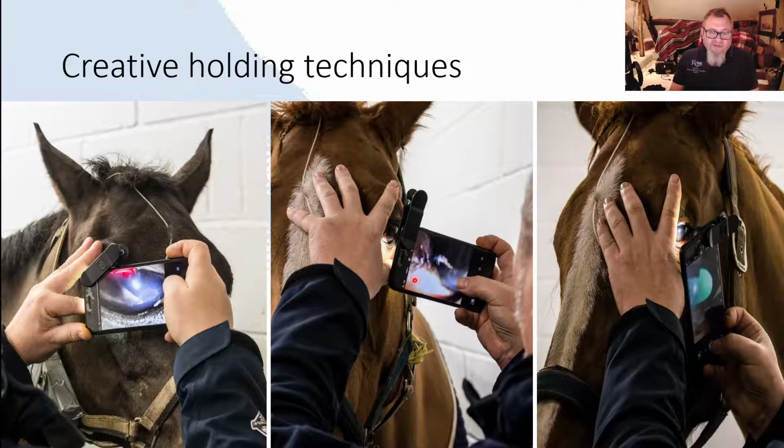In order to focus at high magnification, you're going to need to support your camera with as many points of contact as possible. So you often need a little bit of finger yoga to try and do that. In my first image, I'm using my two fingers to support myself against the horse's head, but also holding the camera, and in my right hand, I'm using my knuckle on the horse's head.